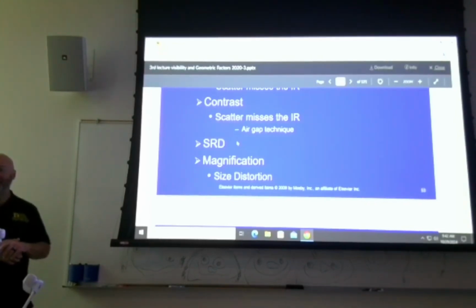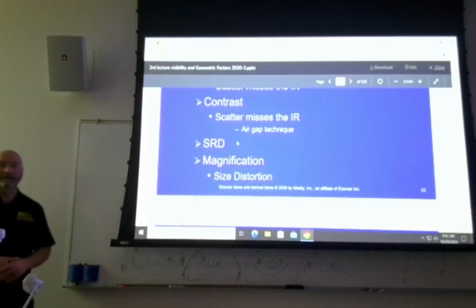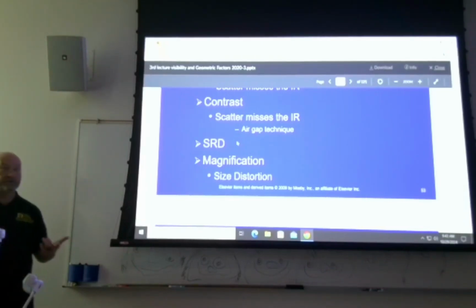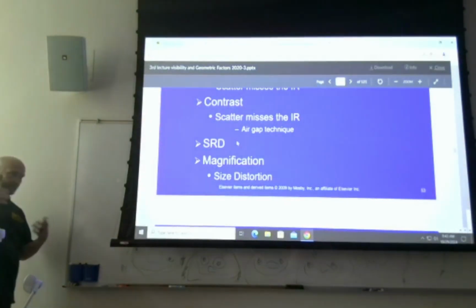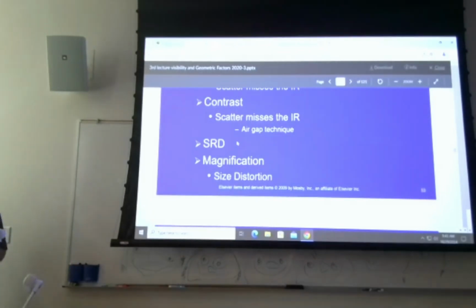Yes. You did. Your shadow did, right? Your shadow did, but you personally, you're the same size, right? But the SID, the OID didn't change. The SID changed dramatically between the house, the street light, and then certainly the sun, right? So your sharpness is brought back even though your relative OID didn't change. Your sharpness increases with the increase in SID.